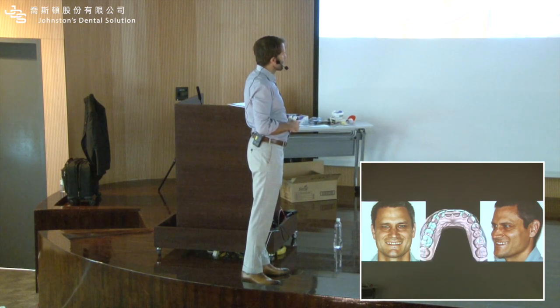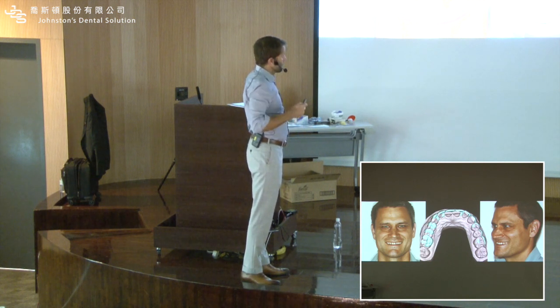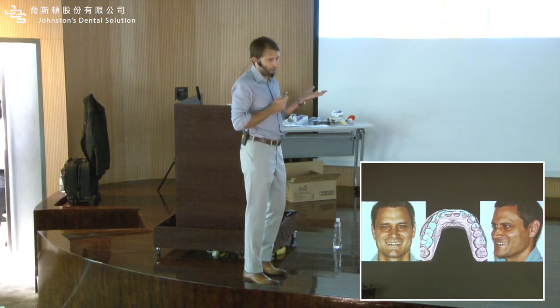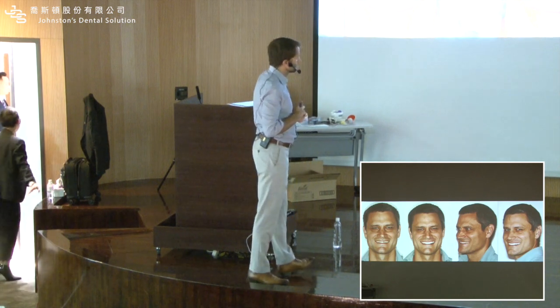Another example of a mock-up. This is the design. See, not an easy case. But then we change this and we make everything bigger. Why? For the mock-up. And then that's the mock-up.